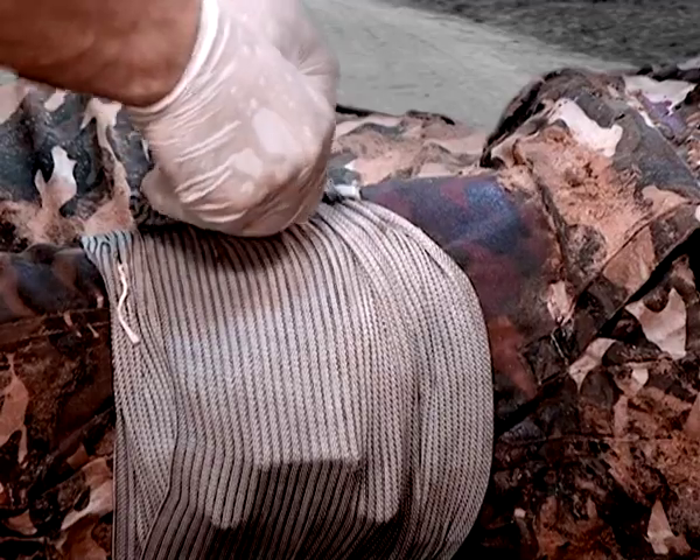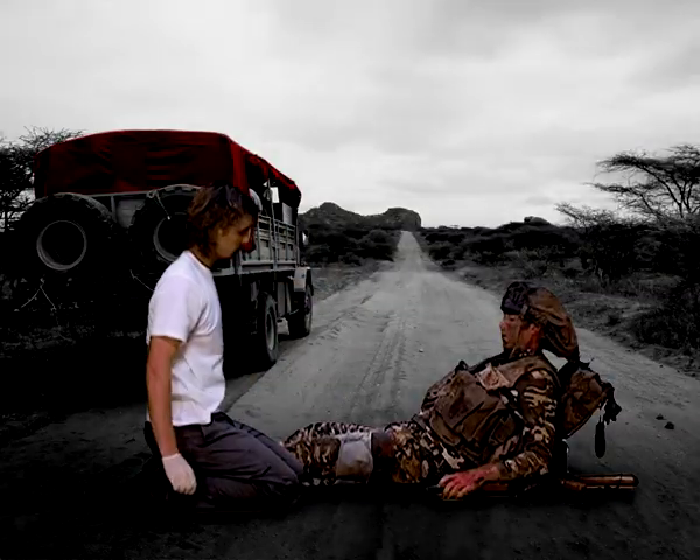To fasten, secure the closure bar at any convenient point on the bandage, the same way you clasp a pen onto a shirt pocket.